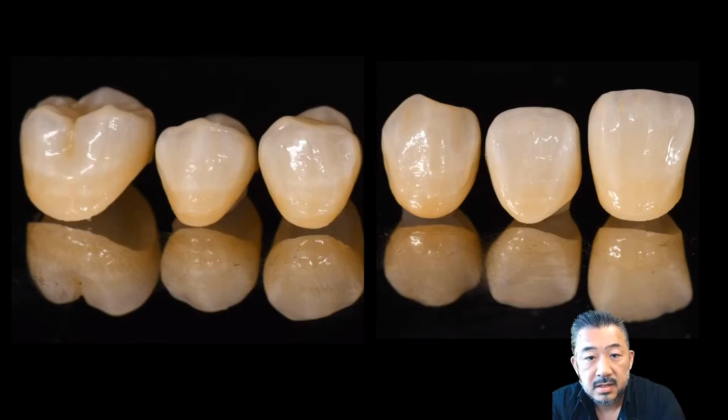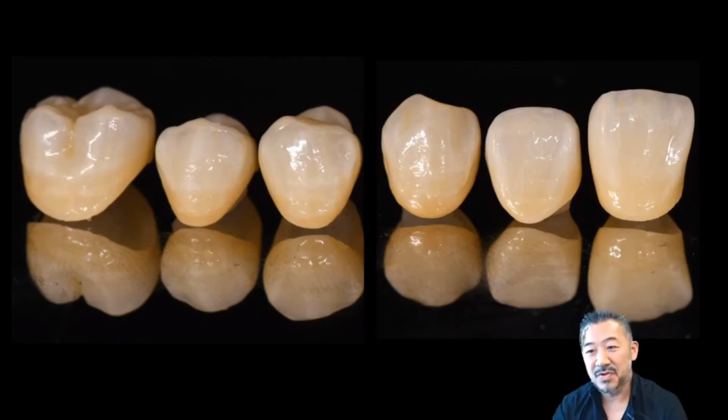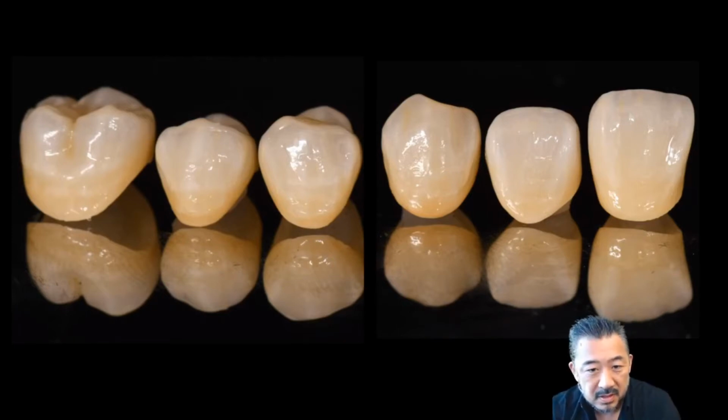Okay, here are the finished states of the crowns for this demonstration. I think it gives a natural feel that you can't think of as a monolithic zirconia crown. See? Doesn't it look very, very natural, right? Unlike before, zirconia discs with high transparency have been sold by many manufacturers over the last few years. So in this case, I use a highly transparent disc.